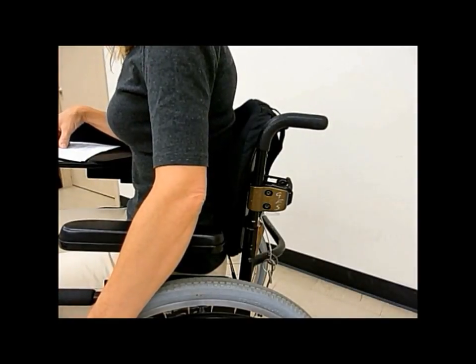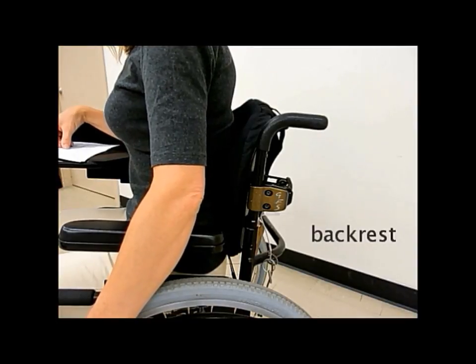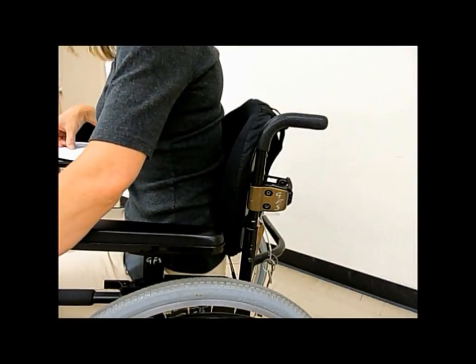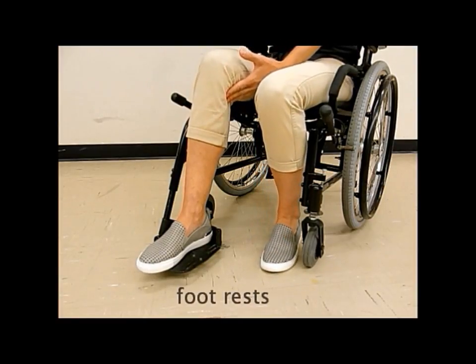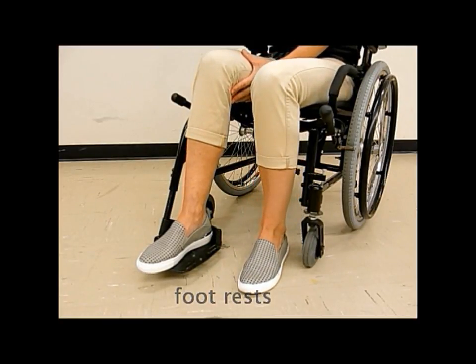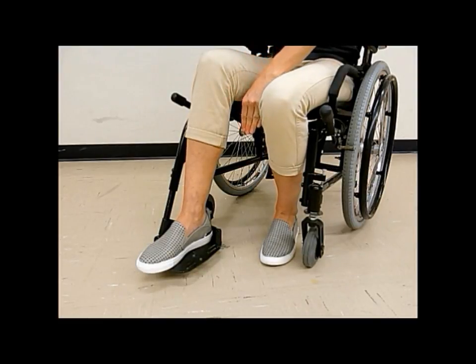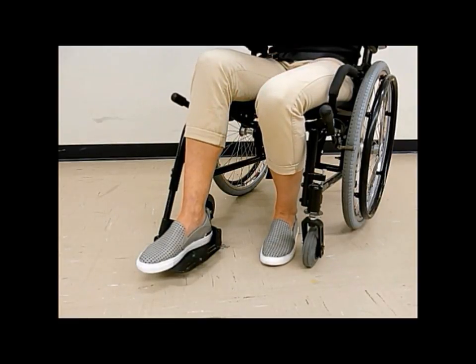For the backrest, you will likely need a solid back versus a sling back to promote adequate support for foot propelling. This can also help shorten the seat depth. So for footrest, the problem with having a chair low enough to foot propel is the footrest often catches on uneven ground. Having a hanger that's not straight down, for example 90 degrees, but more extended, such as the 60-degree angle, can help.